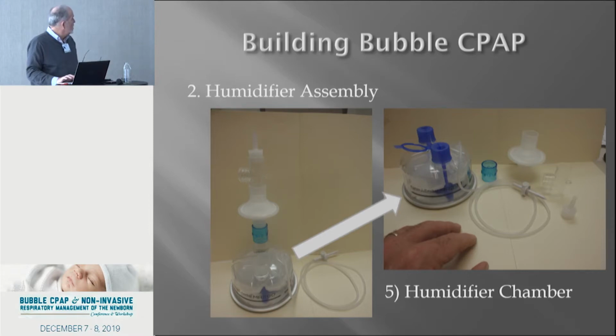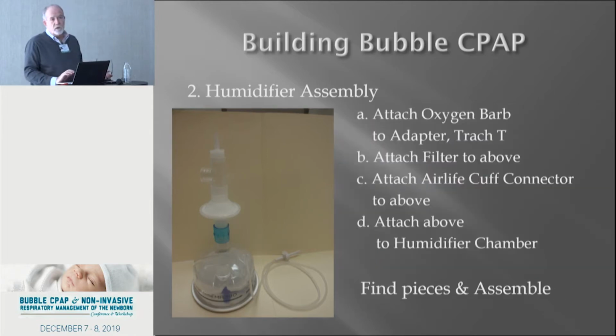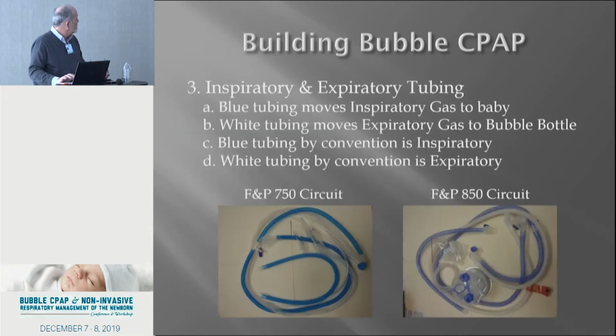And the humidifier is a Fisher-Paykel, you could use whatever. And you get that right there. For those of you who like to read to learn, if you're really quick and I'll move to the next slide, you can read how to do it. Me, I'm a tactile learner. I take my fingers, I put it together, then I know it. But however you do it, here we are. You put those pieces together, you come up with the humidifier assembly.